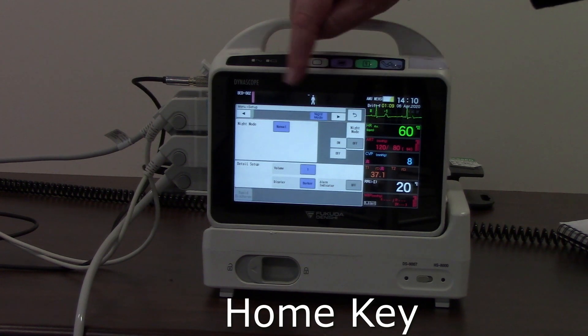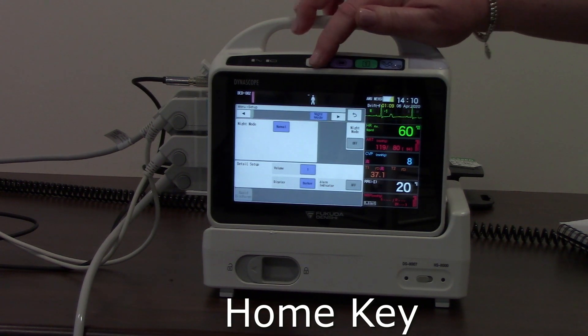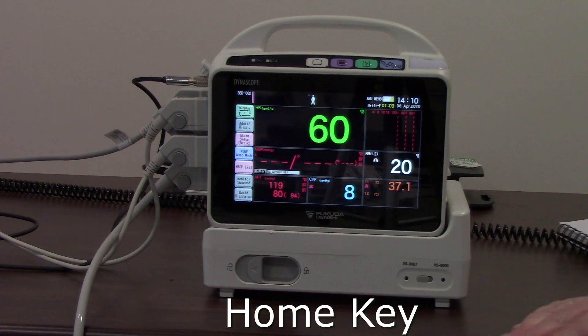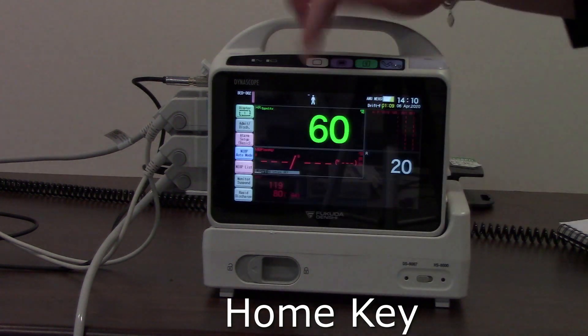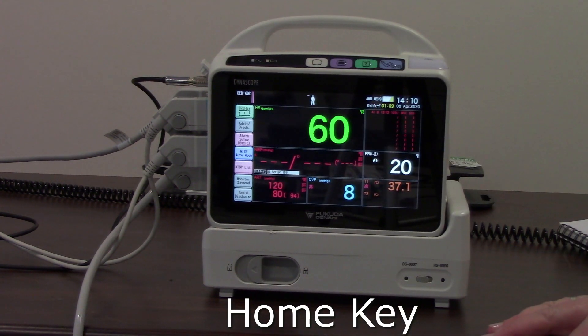The home key will take me back to my main monitoring screen. It doesn't matter what windows or menus I might have open — home will take me back to the monitoring screen.